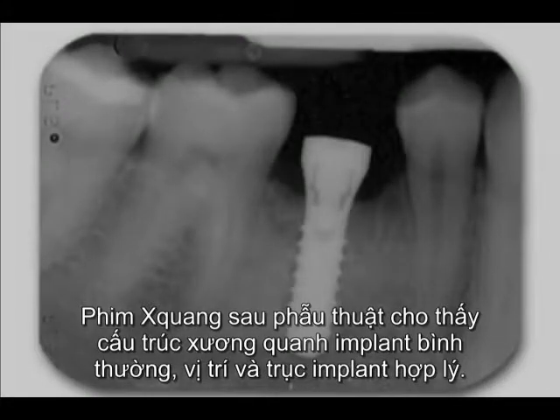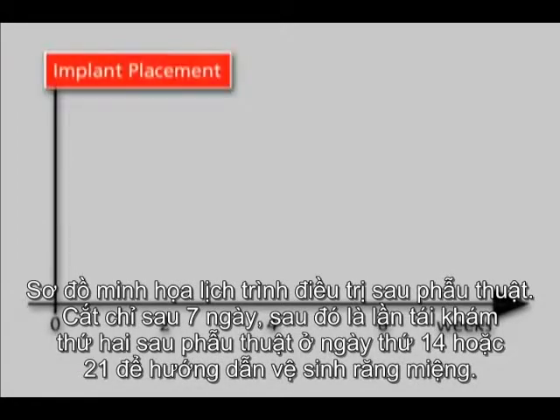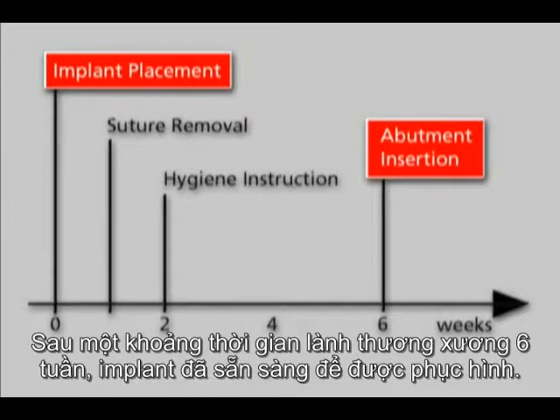The postoperative radiograph shows normal peri-implant bone structures with an appropriate implant position and axis. The diagram shows the schedule for post-surgical therapy. The sutures are removed after 7 days, followed by a second post-surgical visit at day 14 or day 21. After a bone healing period of 6 weeks, the implant is ready for prosthetic reconstruction.